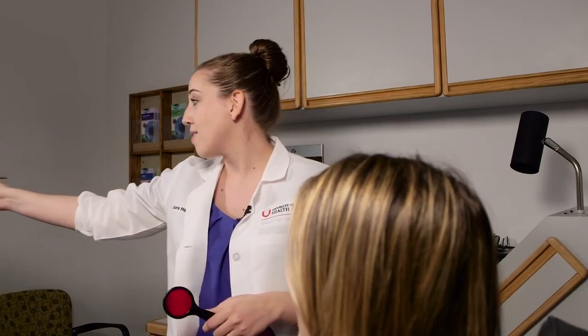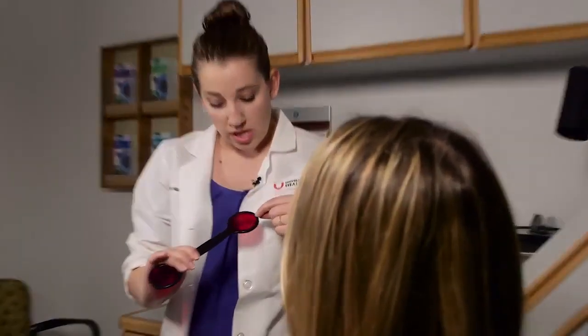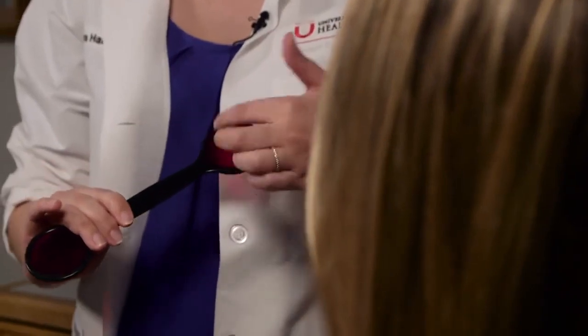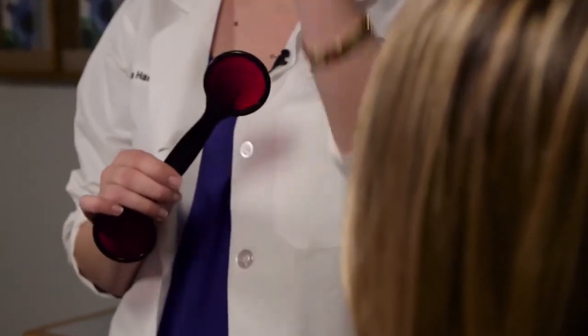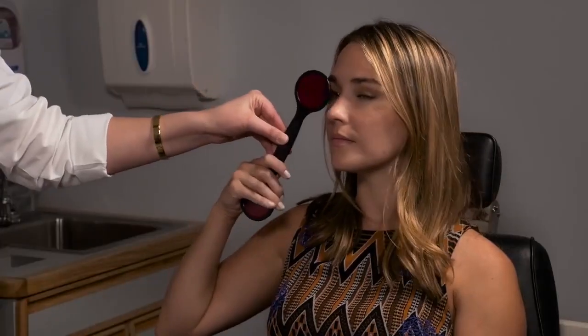For the next test, we're going to do the Maddox rod. I have an assistant here. The Maddox rod is a series of cylinders, and you can have the patient orient them vertically, which will give you a horizontal red line, or you can have them oriented horizontally, which gives a vertical red line. The idea is that you give the eyes two very dissimilar images, and so you can very precisely measure the deviation. So let me have you hold that up over the right eye.